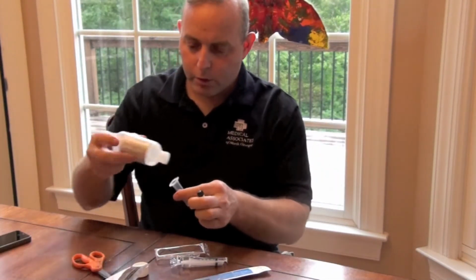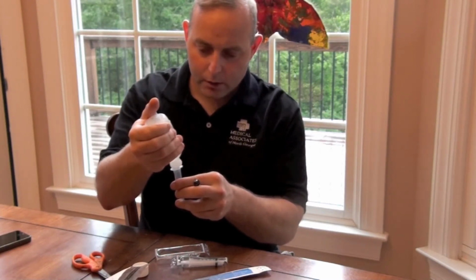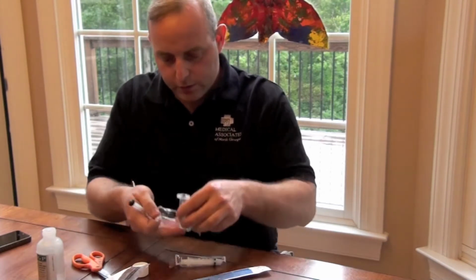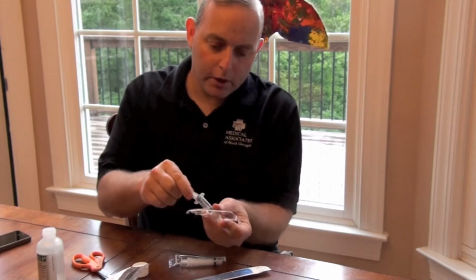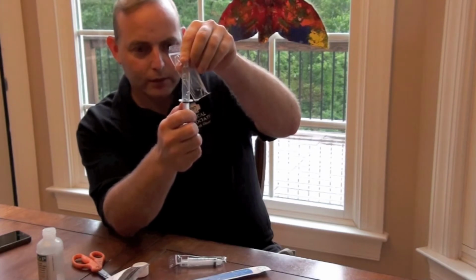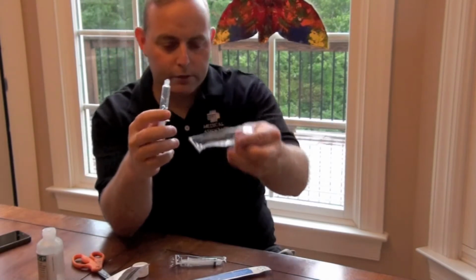Pull the syringe apart and put in 2 or 3 ccs of viscous lidocaine. Cover the cap or the luer lock end, otherwise it will drip everywhere. And it's always nice to save the wrappers because you have to invert it and put the plunger back in without applying pressure, otherwise you'll squirt it all out the end. Let the lidocaine drip back down, and then you can add some pressure and get it back in position without making much of a mess.